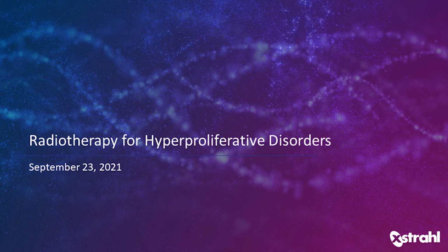So what I did was I made a new cutout, and obviously I gave 5 fractions to the enlarged volume or region treated, but rather than putting the patient on another 3-month break and giving the final 5, the area of overlap was very minimal.